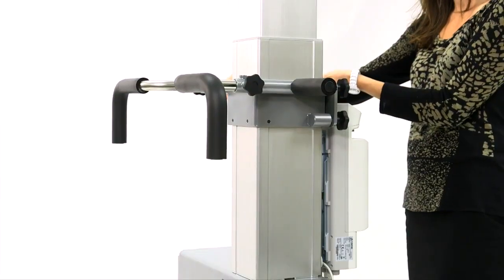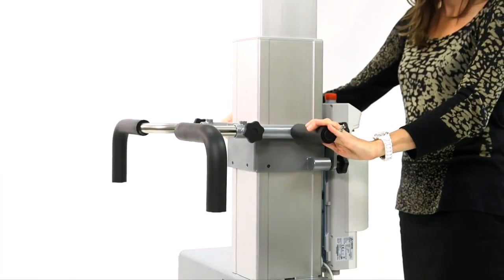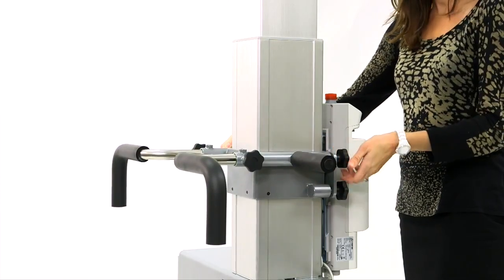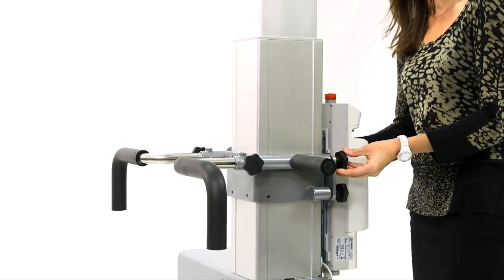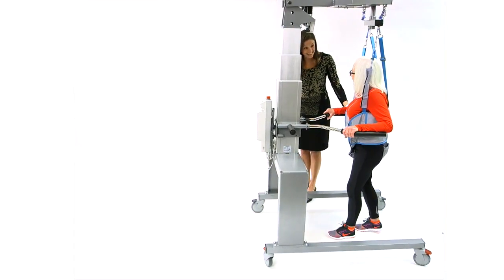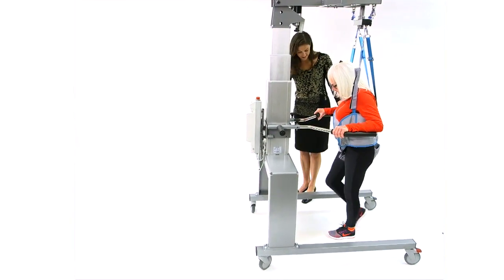The Physiogate comes standard with two interchangeable sets of handlebars. Use the multi-grip handlebars to assist with transfers and the parallel bars to provide extra patient stability while training.